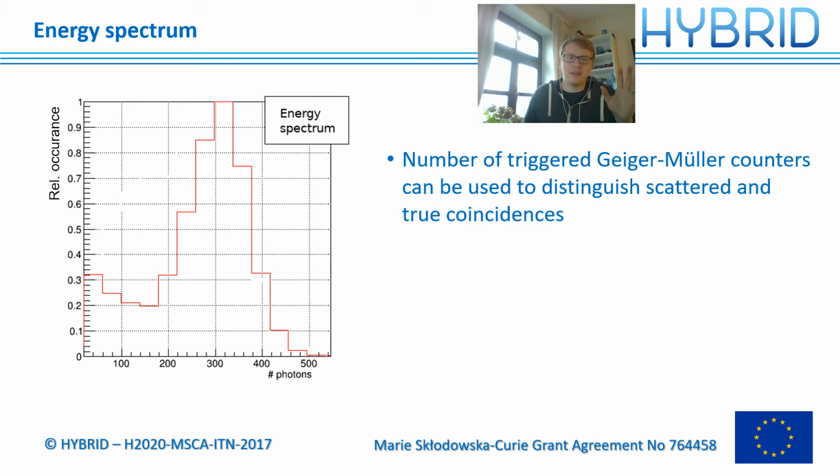So, for example, this is a measured energy spectrum, and say in this case, after the particle hit, we measure 511 keV. This peak here amounts to the uncertainty we have when we measure a 511 keV particle. So this whole peak here.